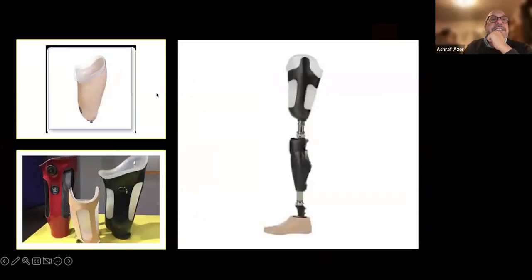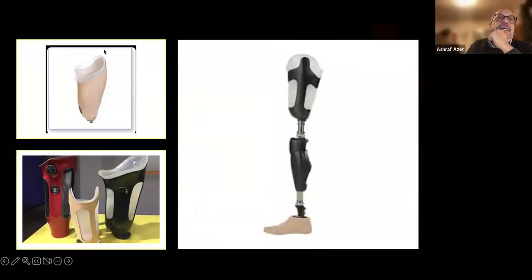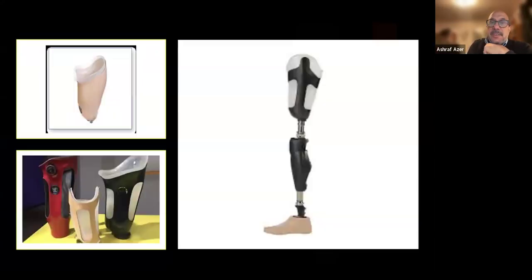Now, what do you think this is? Ischial containing or ischial bearing? Containing. This is high, intimate, going to the groin. Yeah? The same here. Okay? Ischial containing, it looks like a square. Okay? What's attached to the socket here?